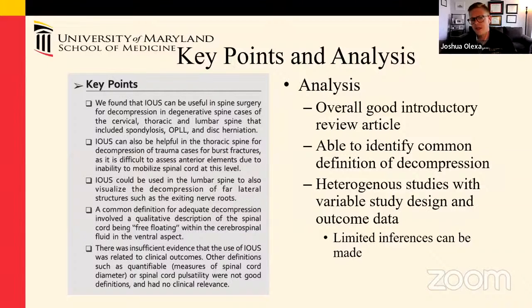And they were really able to identify a common definition qualitatively of decompression, essentially that free-floating concept, which I think is important to note. Again, it's a heterogeneous study to look at a bunch of stuff in the review article. So limited inferences can be made on outcome or other things. But again, nice review of the overall points of intraoperative ultrasound.